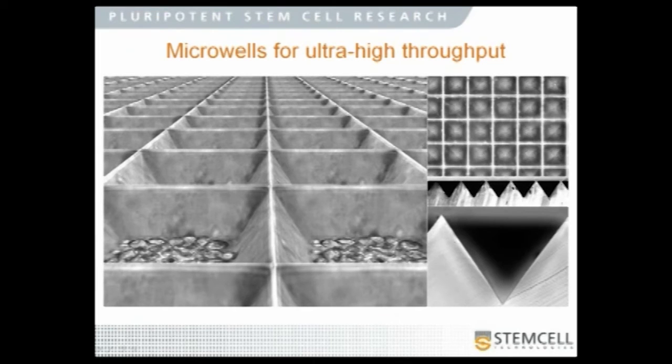in this. And this has a consequence that at the scale of your typical ES cell, so 5 to 10 microns in diameter, the microwells are effectively perfectly sharp, meaning that even at tens of ES cells or any very small number of ES cells, you can put them in and they will still all slide down and encounter one another at the point. There's no surface area at the bottom for them to be scattered across.